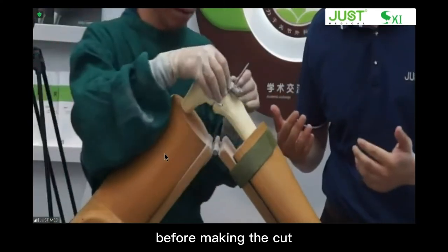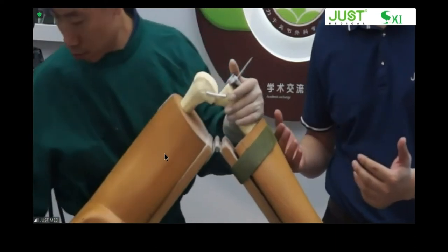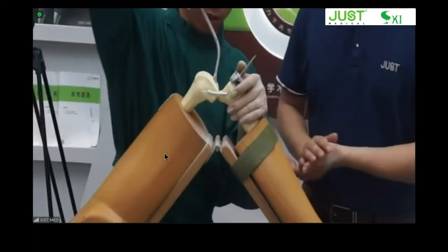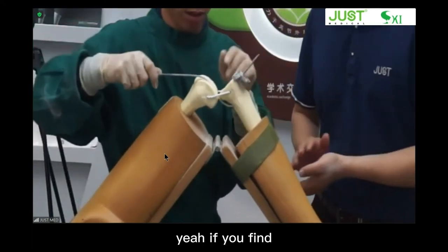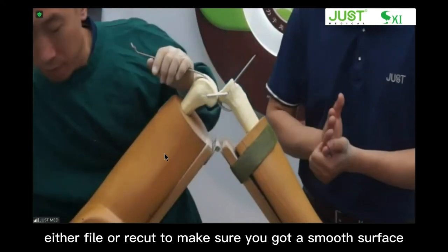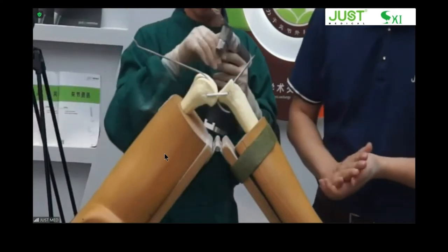Before making the cut, we need to retract the medial collateral ligament to protect it. Then we walk across the tibia. If you find there is a little burr, you gotta remove it, either file or recut, to make sure you get a smooth surface.